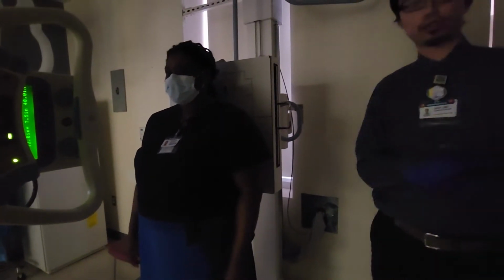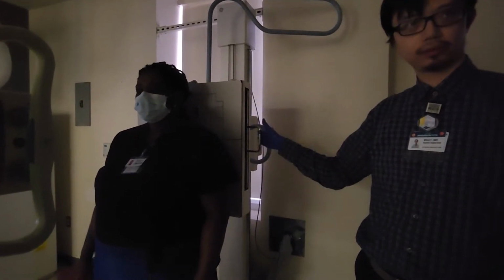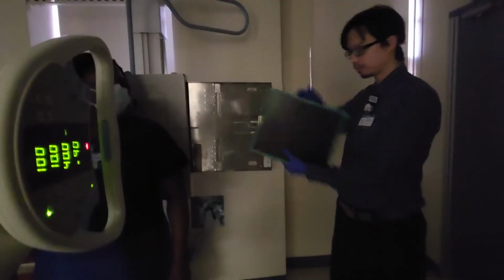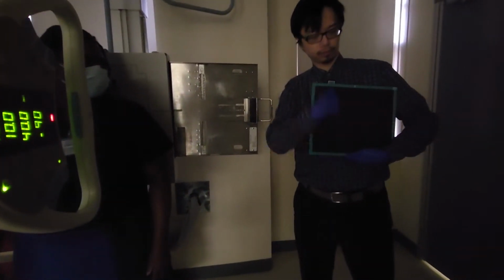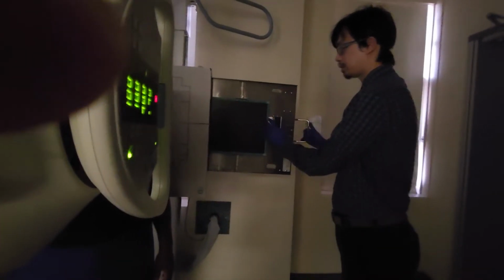So, for the shoulder is smaller anatomy, correct? Mm-hmm. So what do I need to make sure to do? Change the cassette. That's right, we're going to change out this cassette. For the shoulder, we are going in crosswise. So, how tall is this? Crosswise is 10. So I'm going to take this, pop it over to 10, take this, pop it over to 10. Fits perfectly inside. Make sure this clamps in.